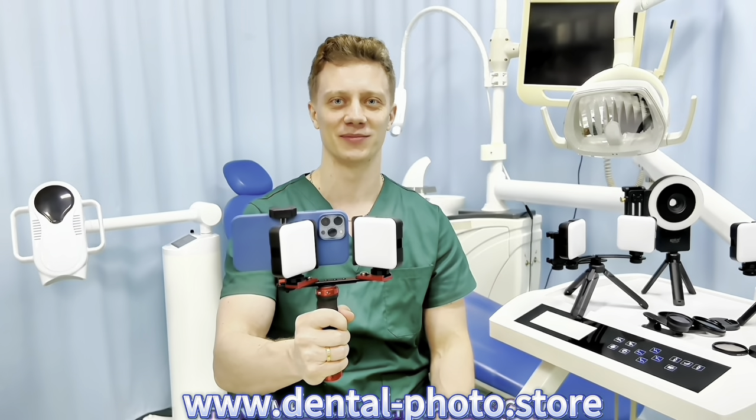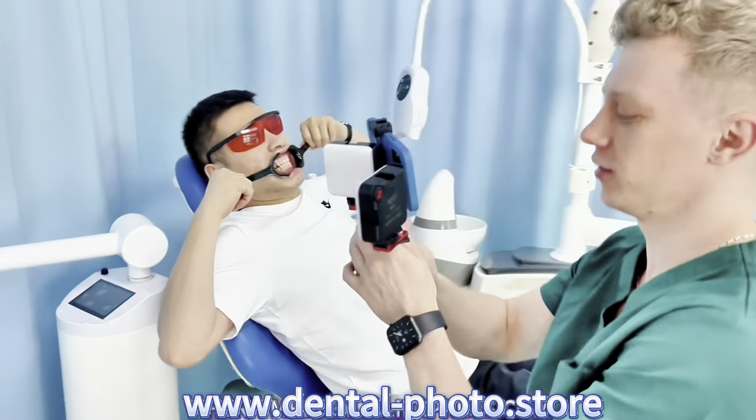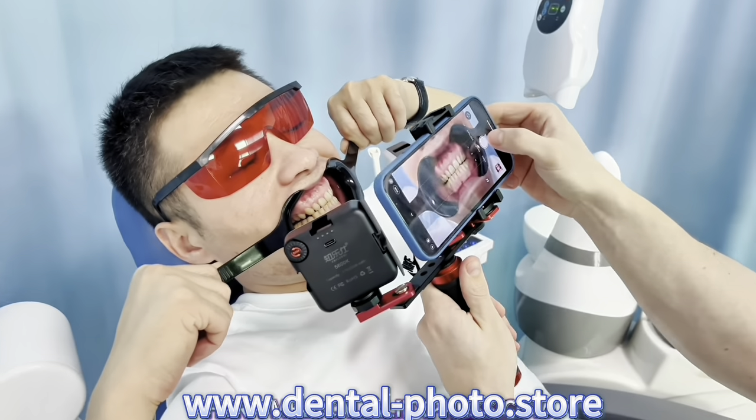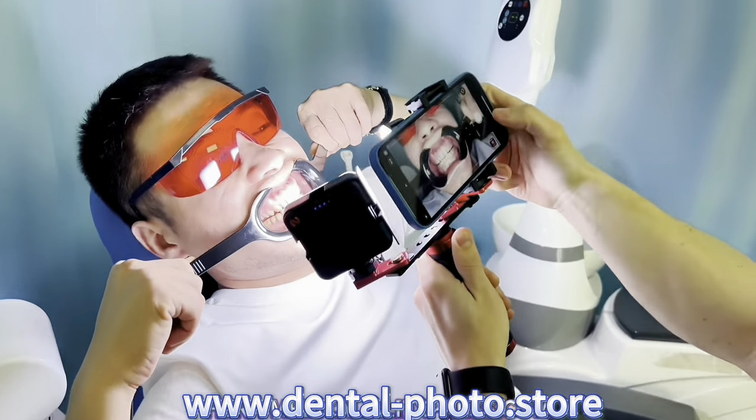It's time to try the MK16 and take a couple of photos together. Now let's compare the photos with the light and without the light. First I don't turn on the light and just take a photo with the light off. Now I turn on the light and take another shot.